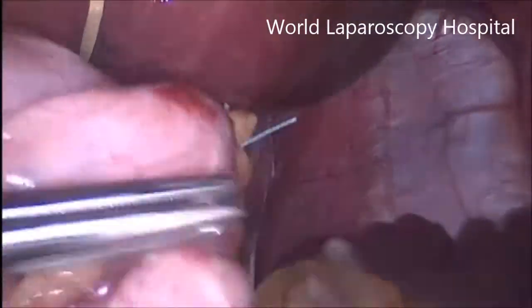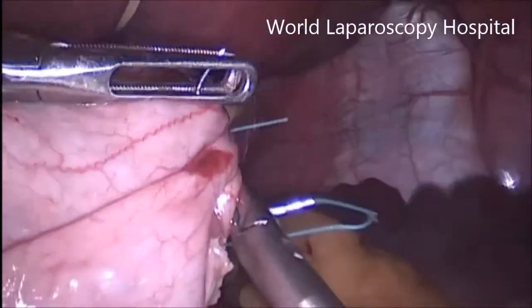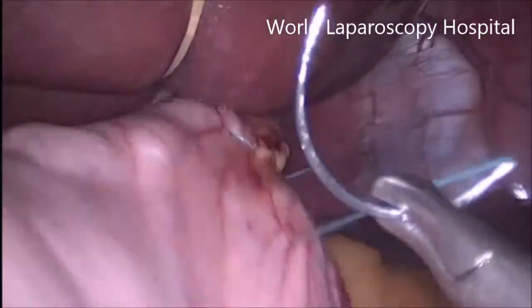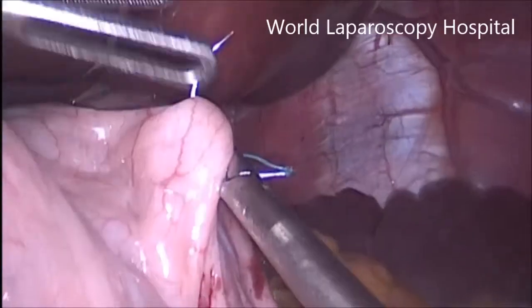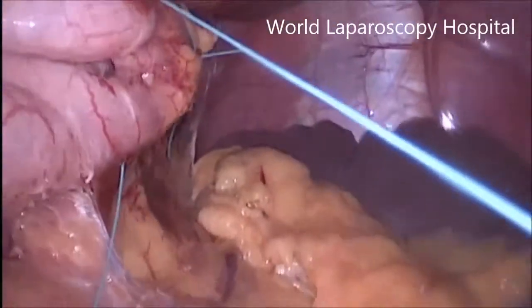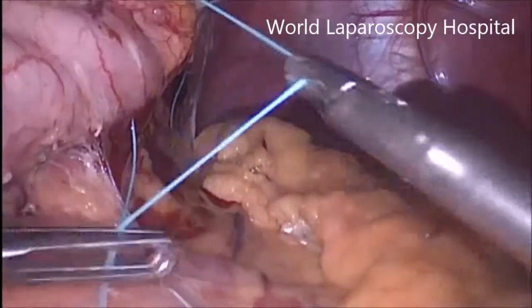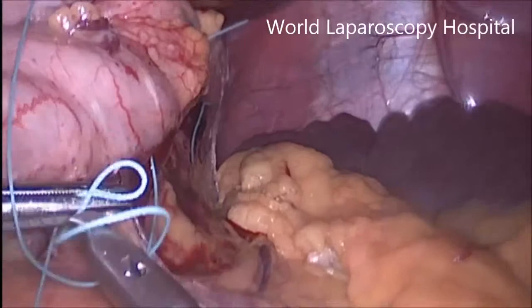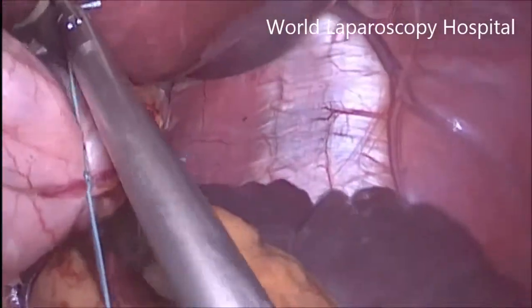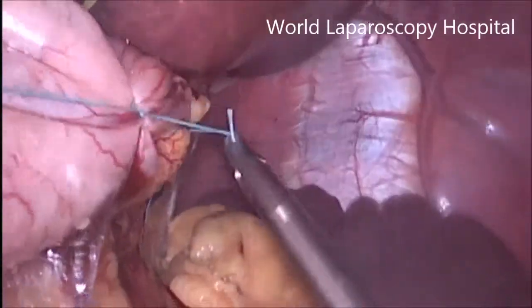Interrupted sutures are good in the first layer, and you can take the posterior wall, then the greater curvature, then another layer, and then the anterior wall. So there will be complete corrugation, and there should not be any space left behind. A long run of suturing is required. This multi-layer suturing comes slowly with experience.